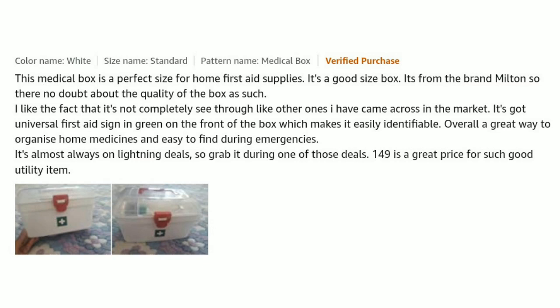This Milton medical box is the perfect size for home first aid supplies. It is a good size box — it's from the brand Milton, so there is no doubt about the quality. I like the fact that it's not completely see-through like others I have come across in the market. It has a universal first aid sign in green on the front, which makes it easy to identify.